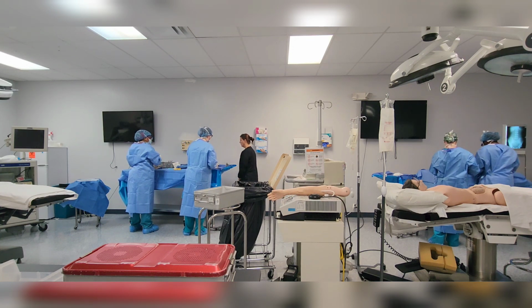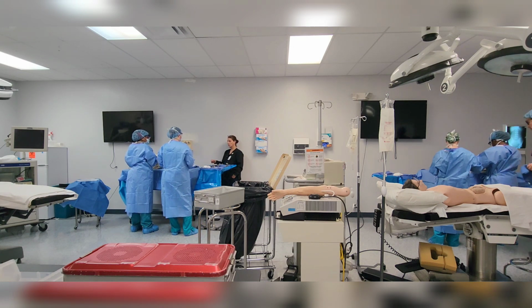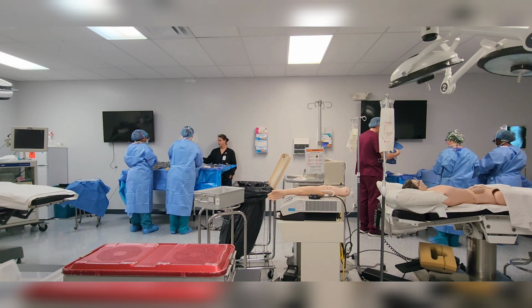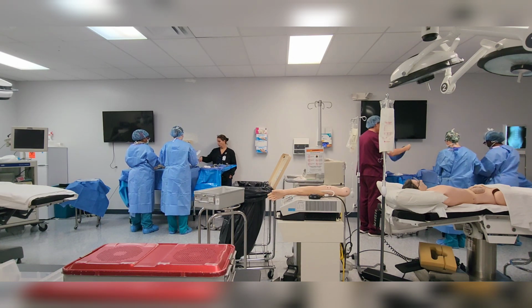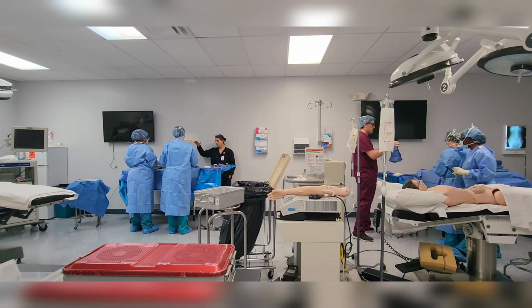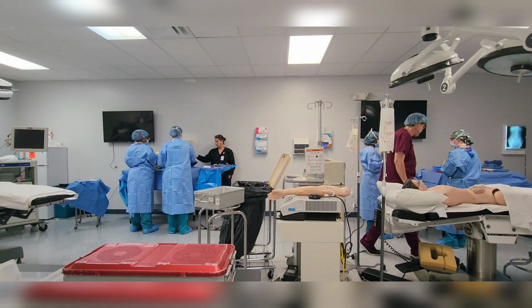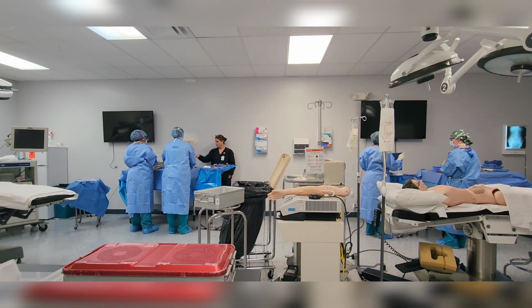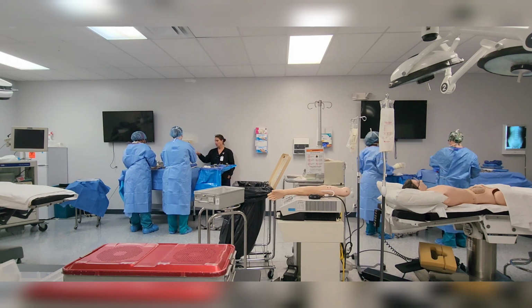So then the other thing is, Brooke, go ahead and do a small towel roll for me. Do you want me to show you one more time? So are you going to do the towels? You're going to go from the bottom, nope, other way. So this on top, towels in the middle. I'm thinking of the way it goes on the patient. Yep, so you're going to do towels in the middle. So the 3/4 first, and then the towels, then there you go.